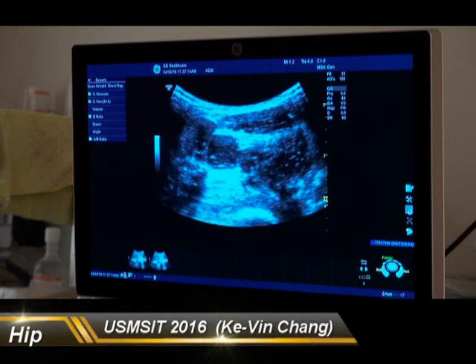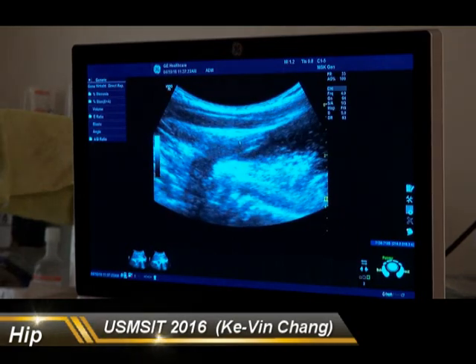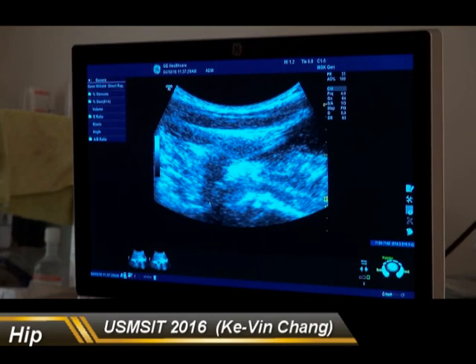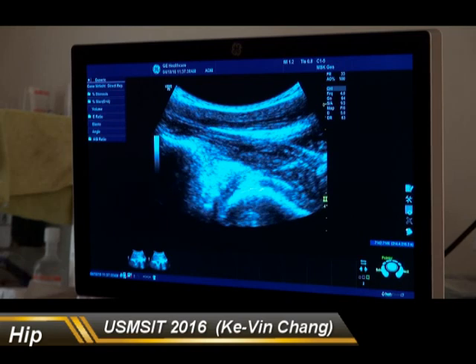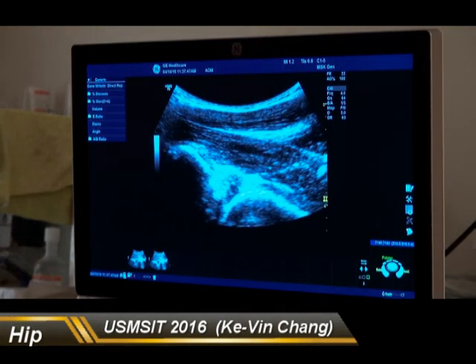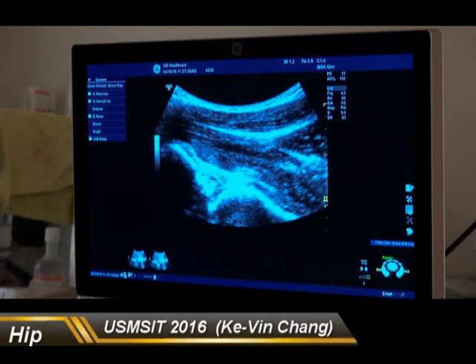This is the tendon of the rectus femoris. Now we change the direction of our probe. In this view, you are going to see the tendon over here — this is the indirect tendon. But if you move the probe to the inferior side, you are going to see the direct tendon. The anterior inferior iliac spine is the direct tendon insertion. Because this is not a mature structure, you are going to see some epiphysis or some cortical irregularities here. This is the anterior lateral hip.